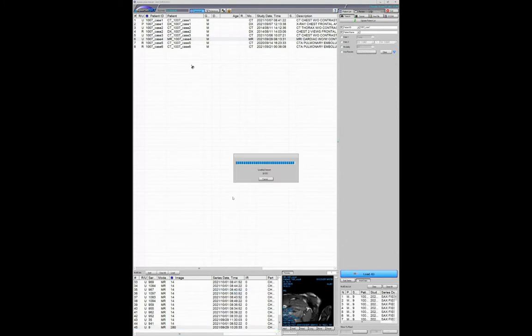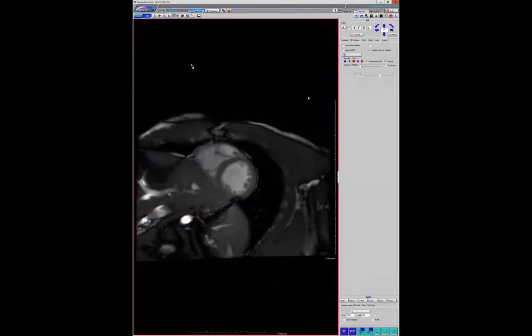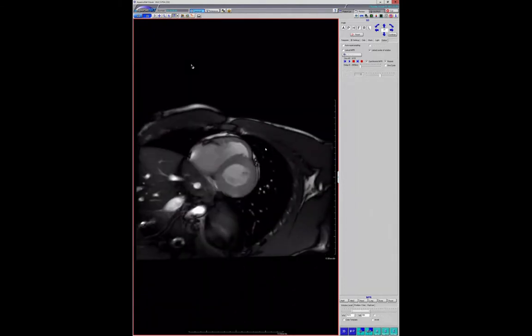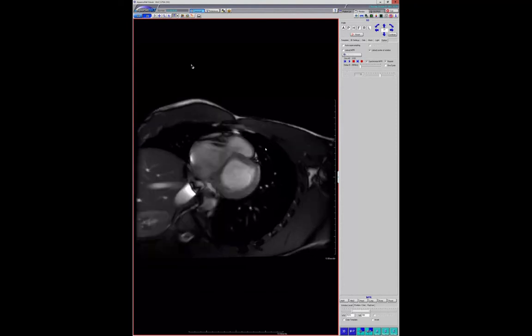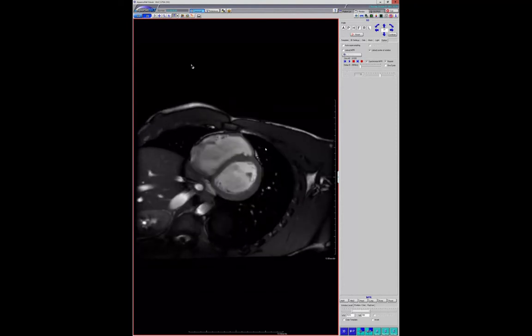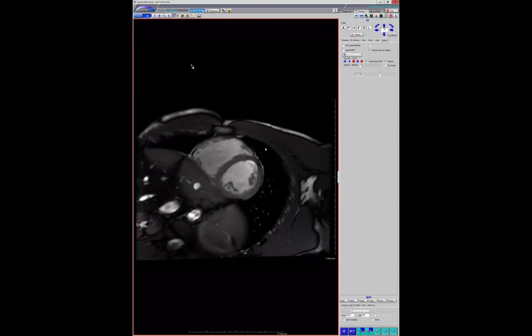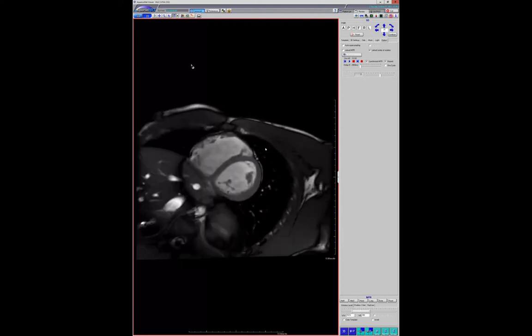This is a good case to show, because I had never seen this before, and I haven't seen a lot of things, but cardiac MRI wise, I think this is really helpful if you're going to do cardiac MR. So this was a young kid, a water polo player, I found out afterwards, who came in, who had an echo after he had COVID. Then he had an echo, and the echo showed left atrial enlargement. And then you're looking at the heart, and if you measure, everything is big. And then you look at his notes, and he is a water polo player at UCSD.